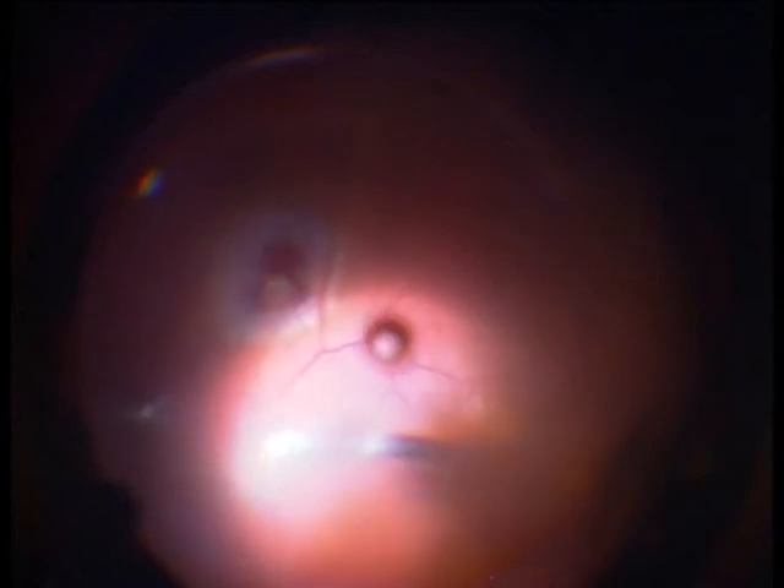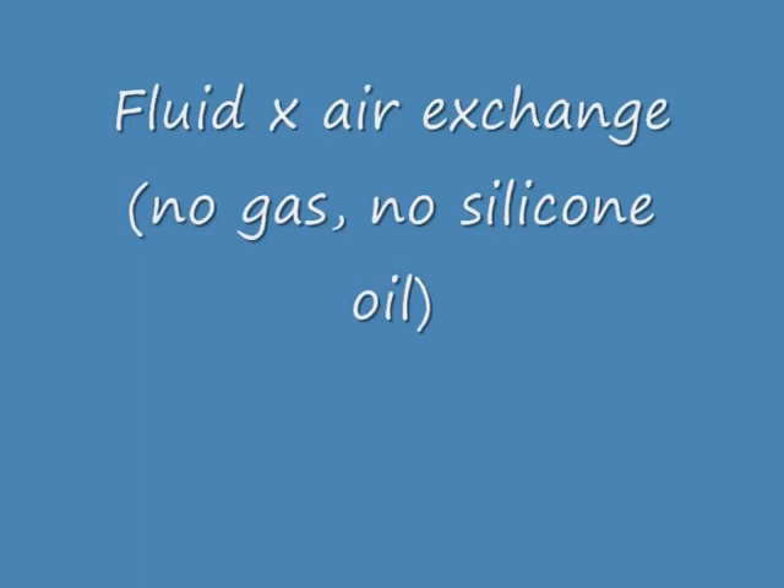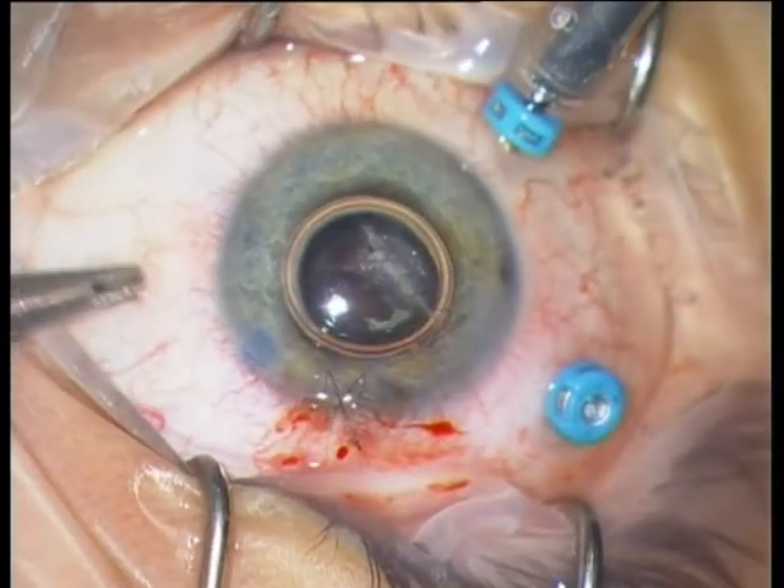The next step is a fluid-to-air exchange. I am using no silicone oil and no gas — that is one more advantage of the four-week waiting period: you do not need silicone oil or long-acting gases. Only air — completely sufficient.